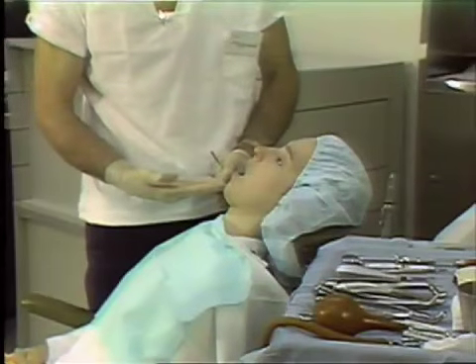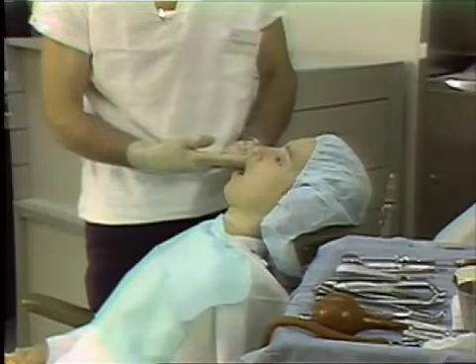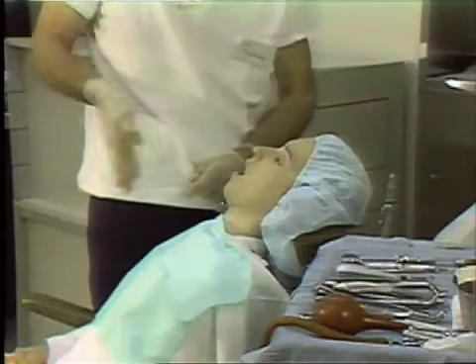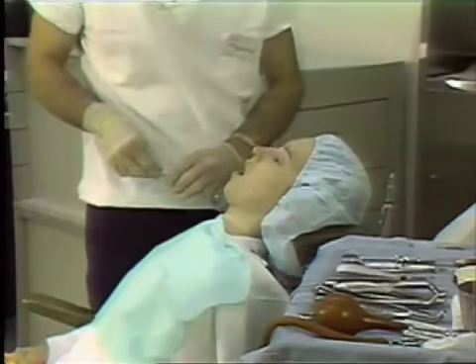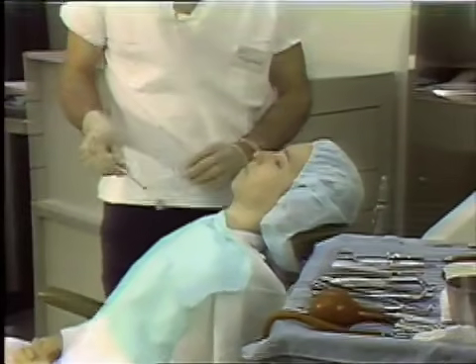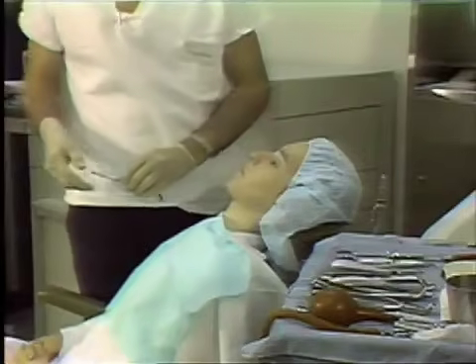A little later on, we will demonstrate that in the maxillary arch, the occlusal plane of the maxillary teeth should be perpendicular to the floor, and the patient then will be tipped way back. Let us attempt to demonstrate here a few of the positions of the operator and the assistant as we go through the access to the several areas of the mouth.